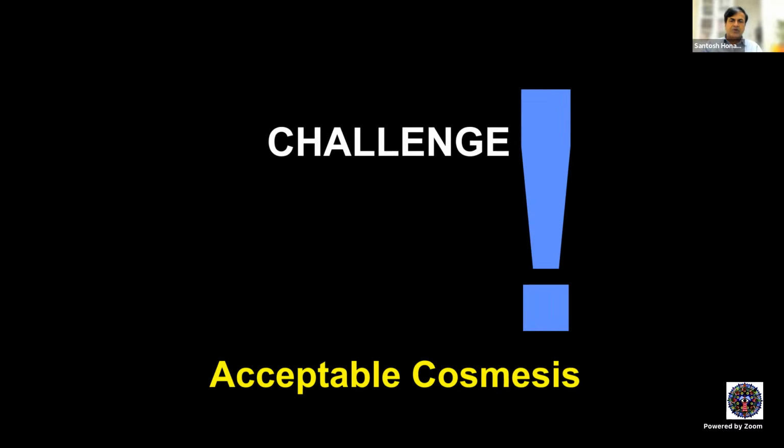Now, acceptable cosmesis is something that is relative. Most of the patients would want a lifelike eye, which may not always be possible because of the limitations in the socket itself or the kind of prosthesis that we have. Some of the prostheses are stock eyes, which really don't do justice to the socket, but custom-made prostheses along with a good implant will provide acceptable cosmesis, if not absolutely matching with the contralateral eye.